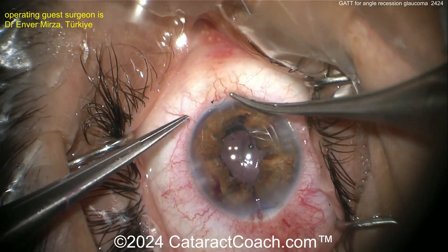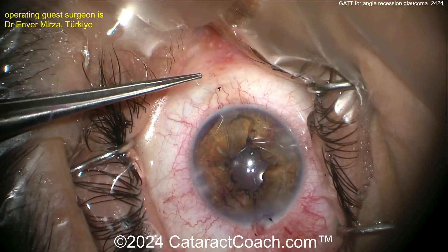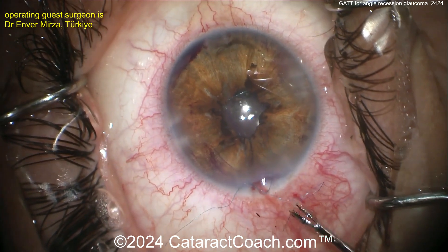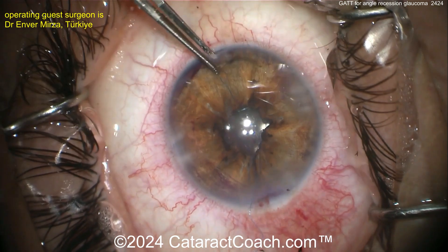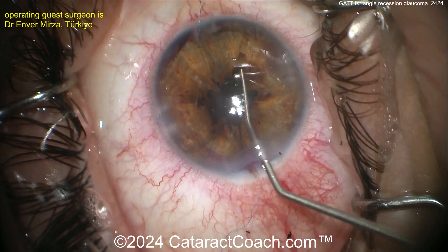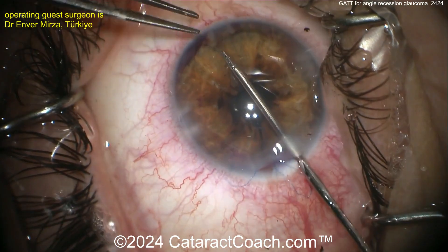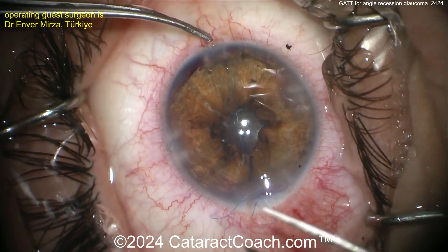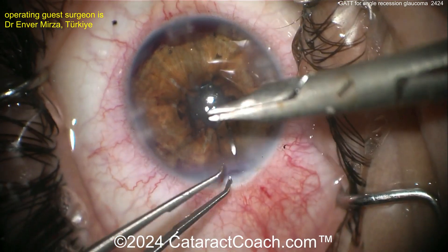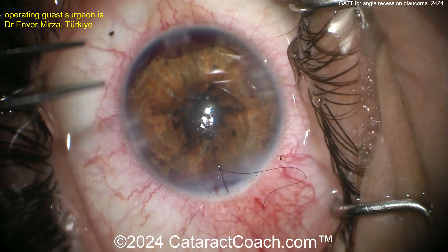This cerclage is gorgeous — an incredible technique — but it is not easy. The surgeon makes it look easy. Look at that outcome at the end: beautiful pupil. Don't make it too small — you want at least a three-millimeter pupil so your retina colleague can actually examine the posterior segment. Tie that up and make it a little bigger. What a beautiful outcome for a patient who sustained such bad trauma and received cataract surgery, a glaucoma procedure, and a pupillary cerclage pupilloplasty.